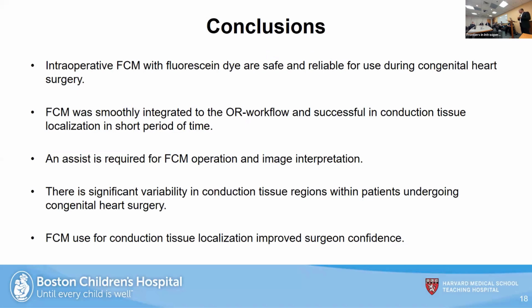As one aspect, there is definitely significant variability in the location of conduction tissue regions, as we have demonstrated. And using FCM by surgeons during these surgeries does improve the surgeon's confidence in terms of doing this surgery. So with that, I'd like to end my talk.